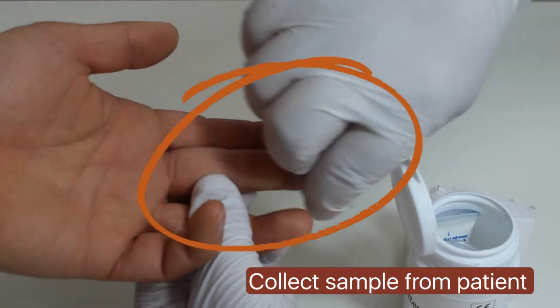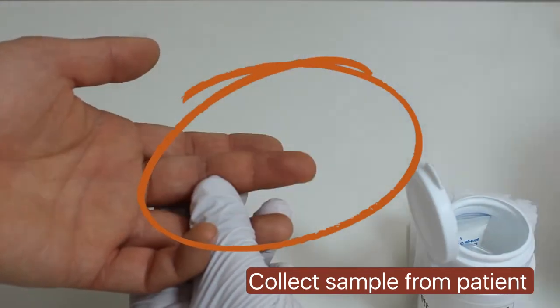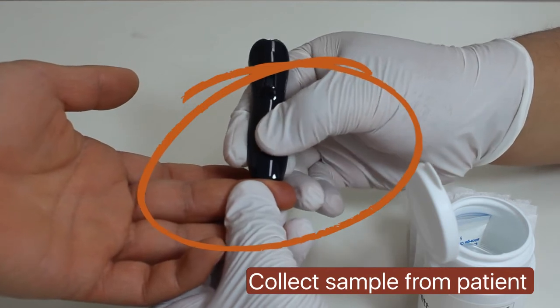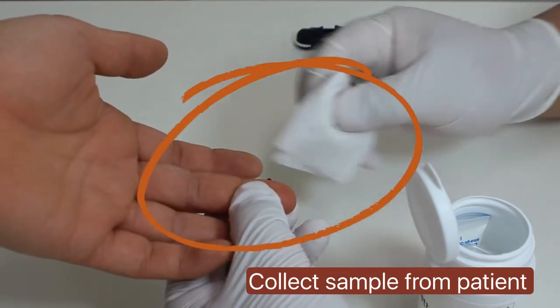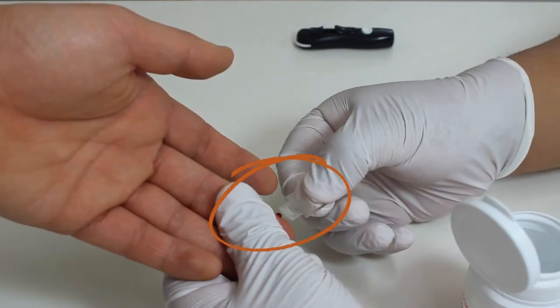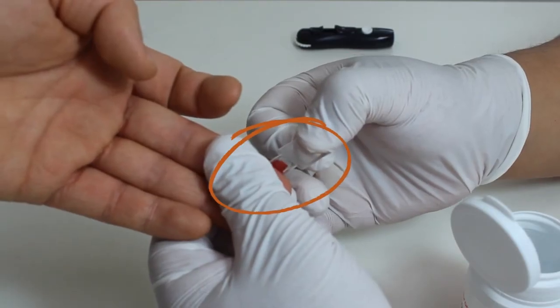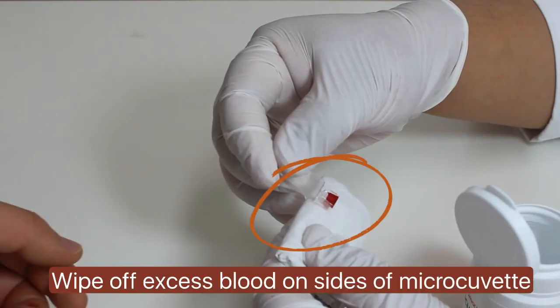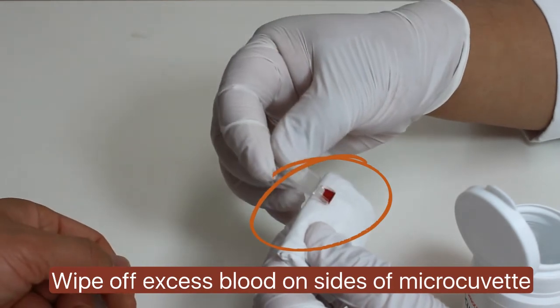Then collect sample from the patient. Draw finger prick blood into a micro-cuvet by bringing the cuvette in contact with the blood drop. Please ensure that the micro-cuvet's capillary area is fully filled. Wipe off excess blood from the surface of the cuvette.